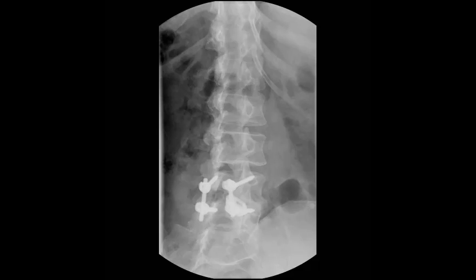Back to the oblique shot. This is the actual image I start with. With the patient obliqued, I count the vertebral bodies. The conus should end above L2. I will typically access at L2, L3, followed by L3, L4. Every case can be different, but for many patients, L2, L3 will be the shortest path from skin to target.